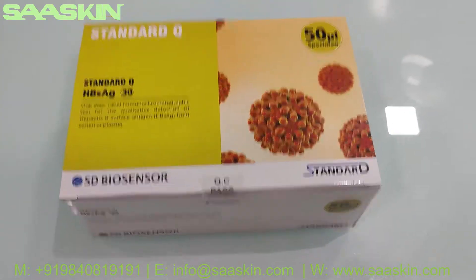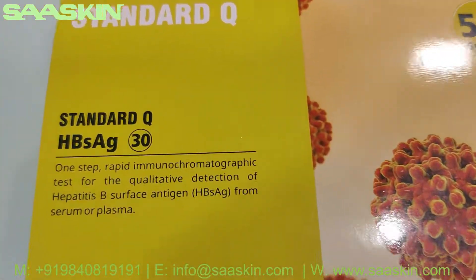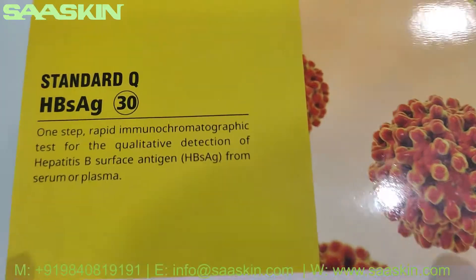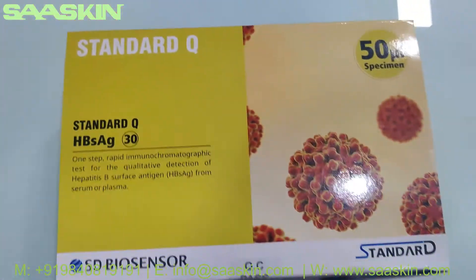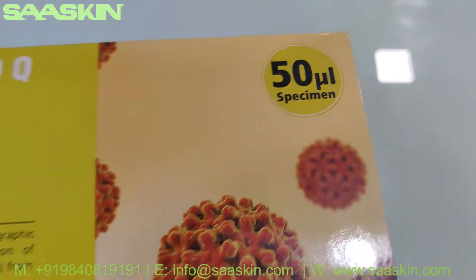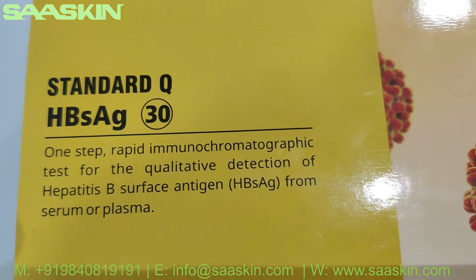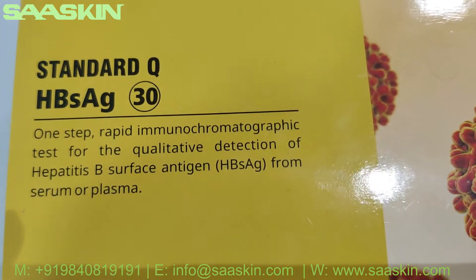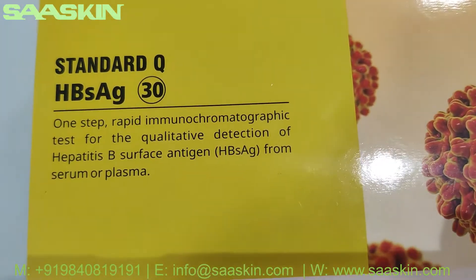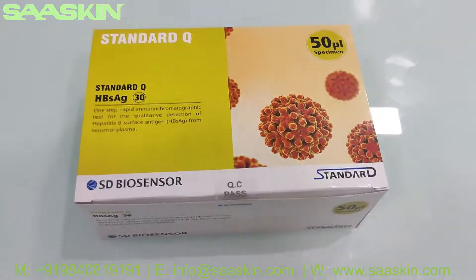Hello everybody. I'm going to unbox the SD Biosensor Standard Q HBsAg test kit box. It says it's a one-step rapid immunochromatographic test for the qualitative detection of hepatitis B surface antigen from serum or plasma. So you have to make sure your sample specimen is serum or plasma.